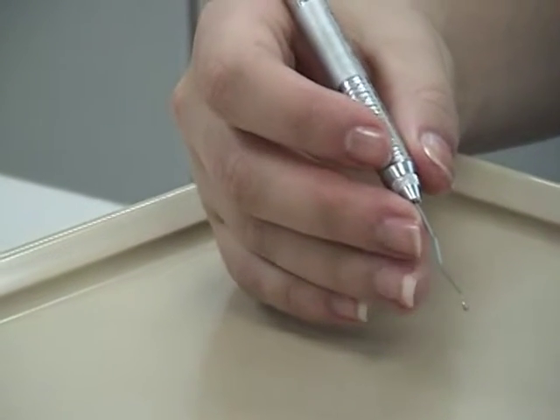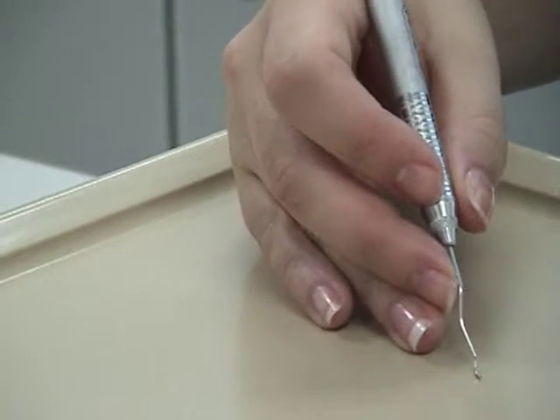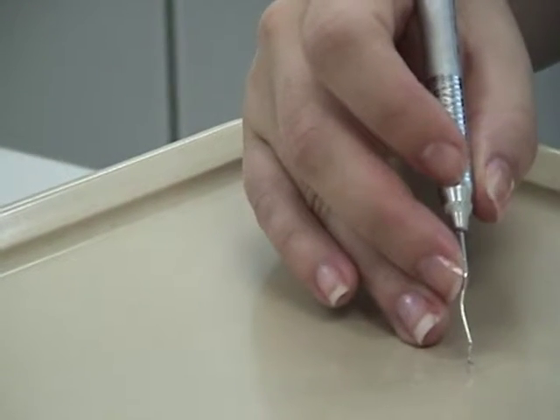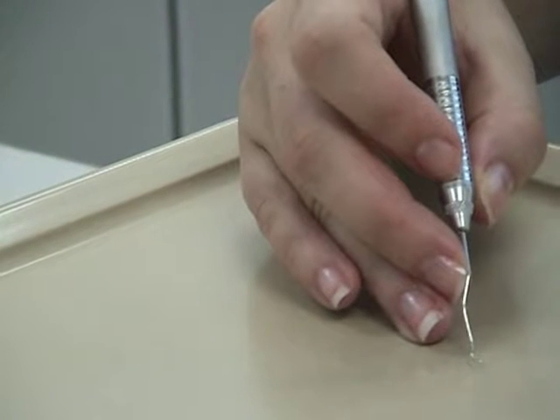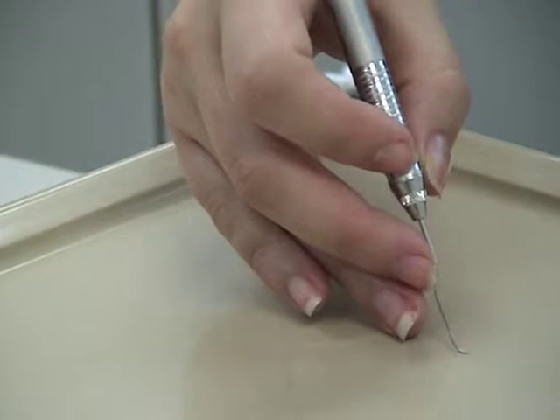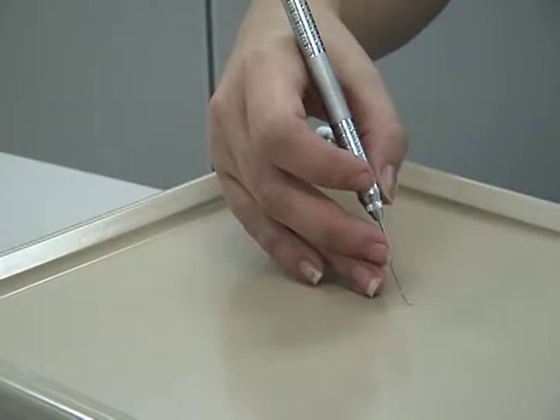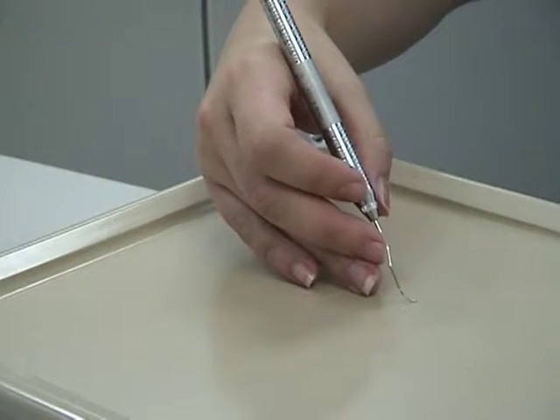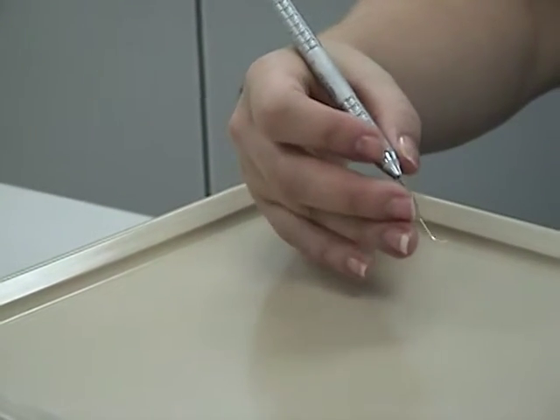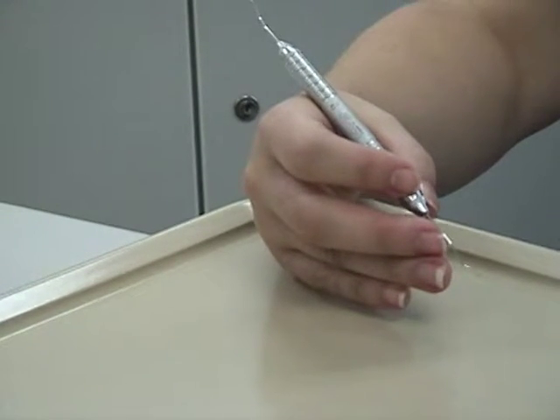The ring finger acts as a fulcrum, a support for the hand and instrument. The fingertip of the dominant hand balances firmly on the tooth to support the weight of the hand and instrument, held straight and upright to act as a strong support beam. The fulcrum finger advances ahead of the other fingers and should be within two to three teeth of the area being instrumented. The little finger rests against the ring finger in a relaxed manner and has no function in the grasp.